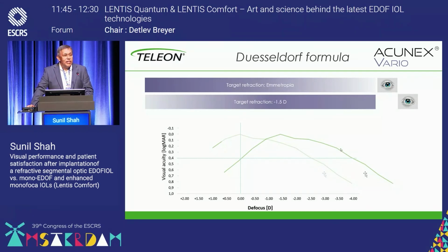So without losing anything, because if you look at the defocus curves, I mean, these aren't summated, they've not been added together, but you can understand that effectively what you've done is you've increased the area under the curve without dropping the peak at all. So it's a very effective technique. You may want to try the patient for monovision, but Detlev, I don't think, has bothered. He just puts this in, and patients don't seem to notice the difference between the two. I mean, you obviously warn them, but they get such good vision across the range that it's not necessary.